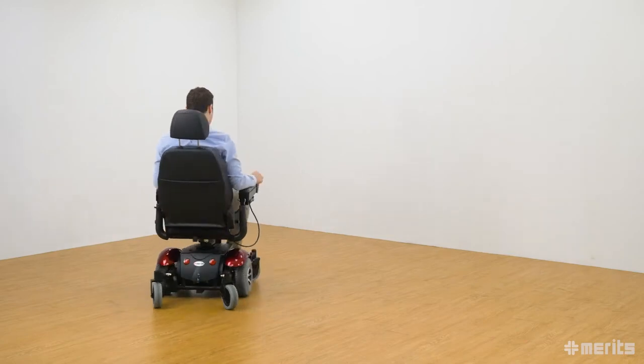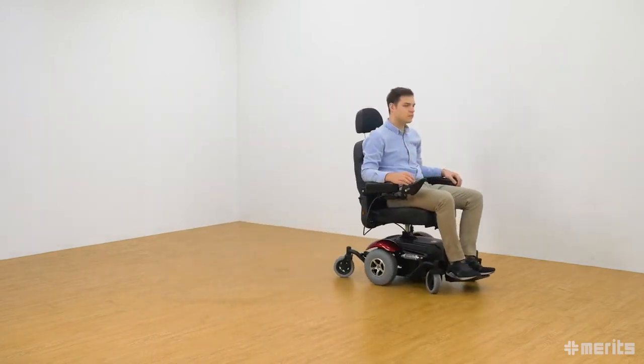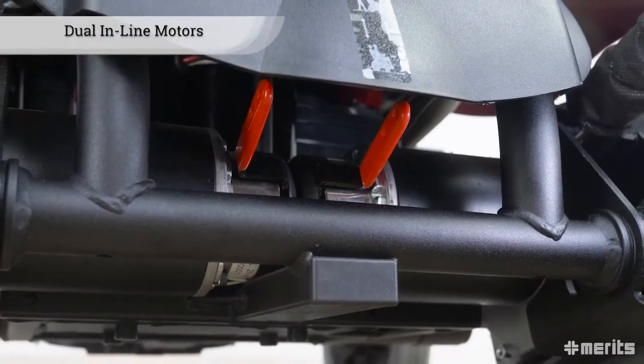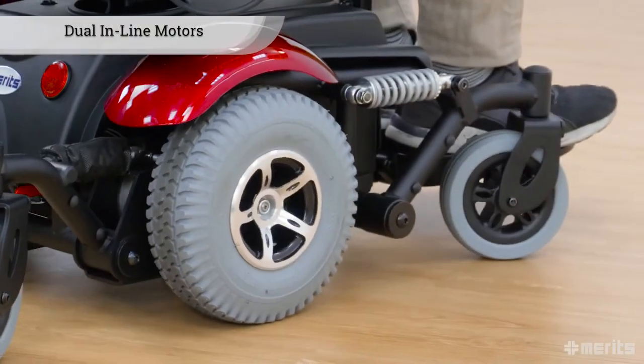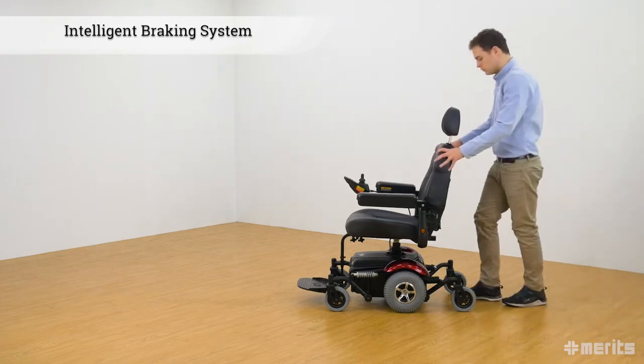The P326D maintains a noticeably stable centre of gravity, reassuring the rider that he or she is always in control of the chair. The dual in-line motors make for an extremely robust and capable powertrain. The P326D's intelligent braking system locks the chair in place to prevent unwanted rolling.